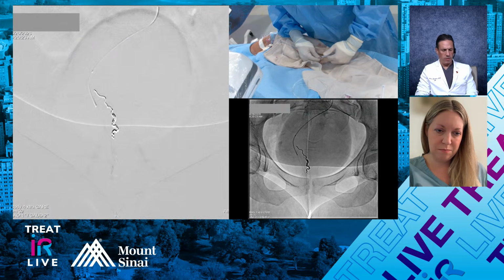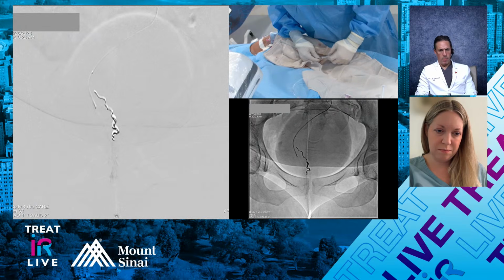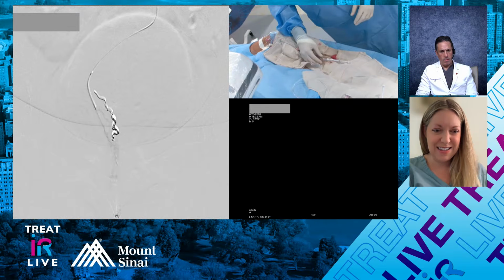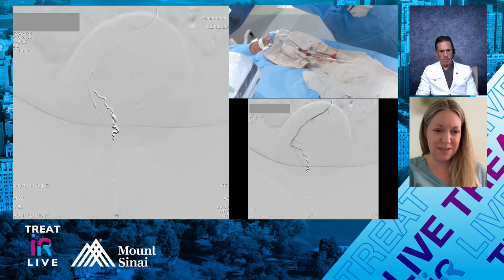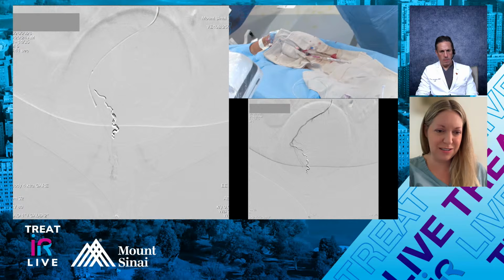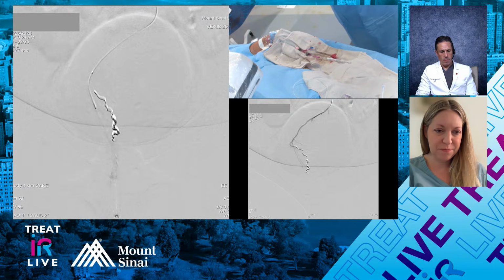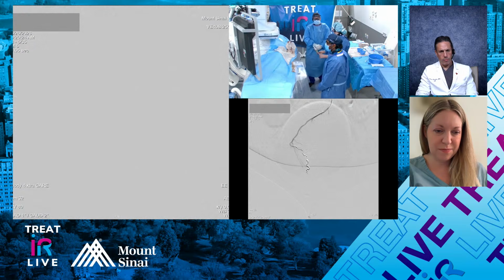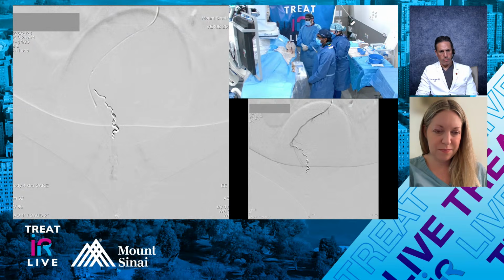That's a tiny vessel, though. I needed a really small wire. I'm not as good as Jay, but I think it was not difficult to get into. Yeah, we would still think you're good there. The other thing we're looking for obviously is whether you see some collaterals from the middle rectals here, just so you can catch that on your angio sometimes.